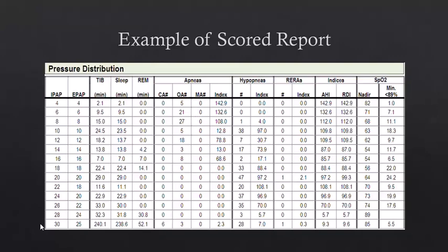But as you get to these super high double digits, that's when you really want to slow down. They went from 28 over 24 to 30 over 25 and then left the patient there for 4 hours. Ultimately, the patient probably did best at 28 over 24.